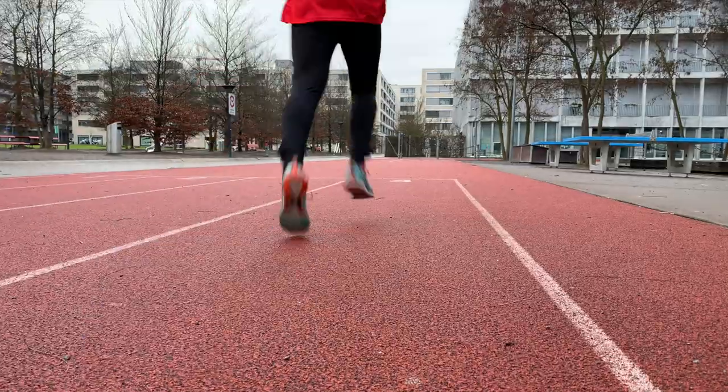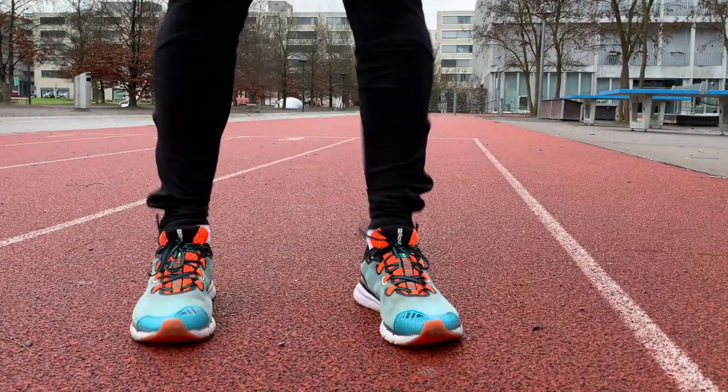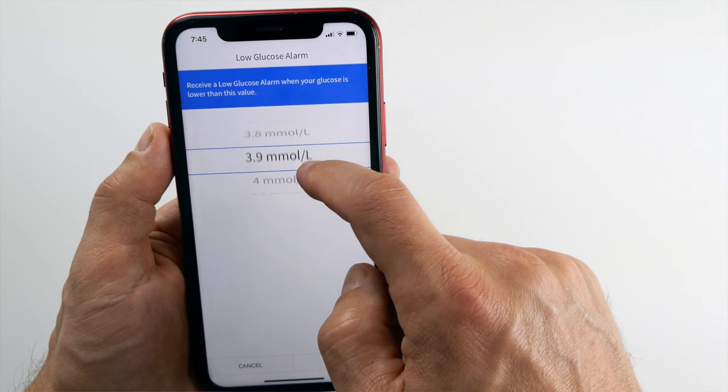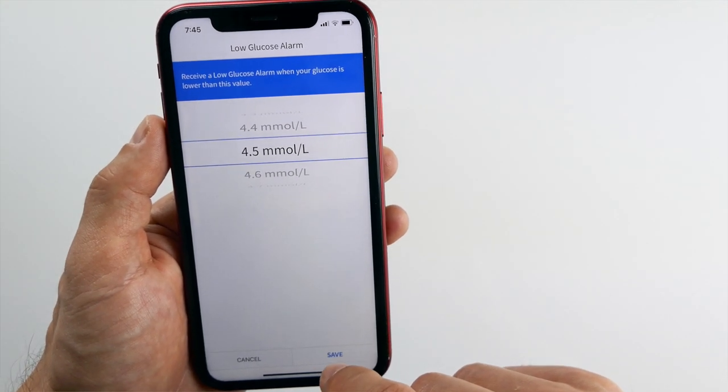Step 5: consider special situations. What if you want your Libre to alarm you at different levels at different times of day — for example, running a little higher or not being bothered by alarms when you work out or sleep? Unfortunately the Libre app and reader don't allow you to set different alarm levels during different times of day, so you always have to change the alarm levels manually. But there is a solution: a DIY solution using a third-party transmitter like MiaoMiao or Bubble and their own mobile app. If you want to learn more about these third-party solutions, click on the video on screen right now.